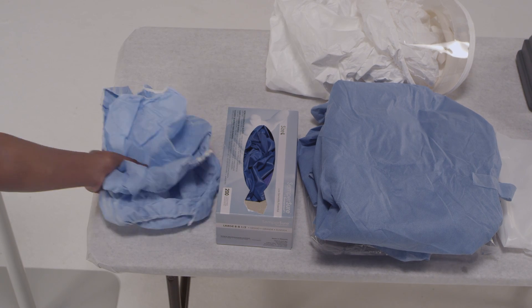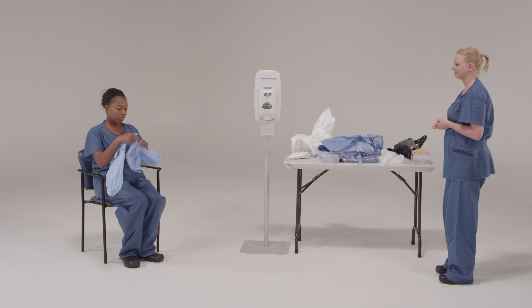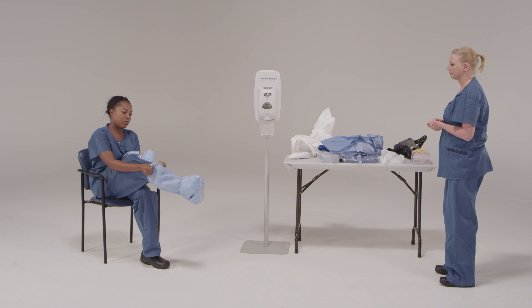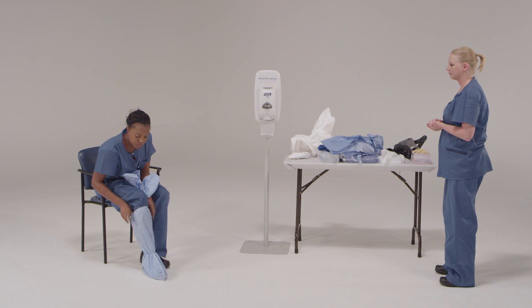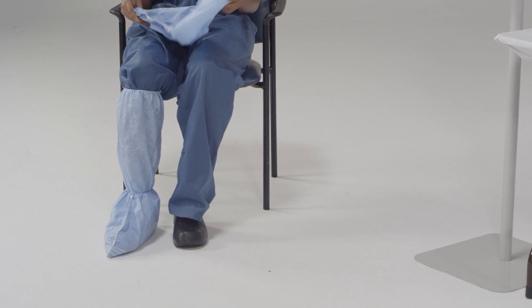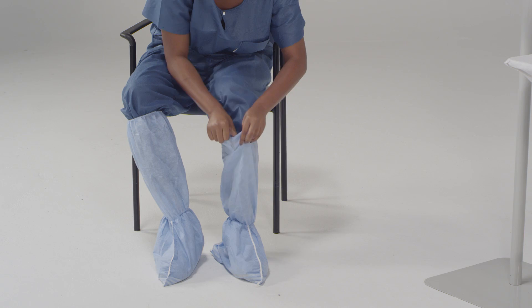Now we're going to put on your boot covers. For safety, go ahead and sit in the chair and take your time. Make sure that all areas of the foot are covered and the boot covers are snug over your ankle and calf. If your boot covers have a strap, wrap the strap around for a comfortable fit. Try not to touch the floor or other areas with your hands while putting the boot covers on. If you do, disinfect your hands before putting your inner gloves on.